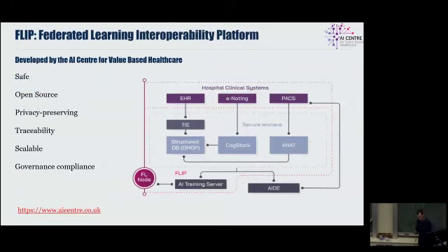Having that in mind, we developed FLIPs. FLIPs is basically a system that enables federated learning, and that's hooked into the clinical environment. It's going to hook into the electronic health record on the left-hand side. It's going to hook into the PACS. So at the top, you've got the clinical system. In the middle layer is a buffer that we are creating, where we are reformatting and curating the data on the fly, and reorganizing it with a nice ontology so that we basically label every data set.